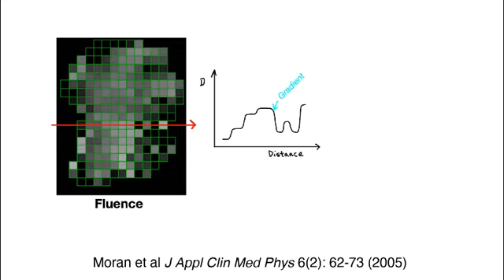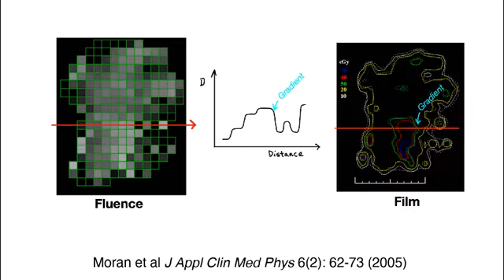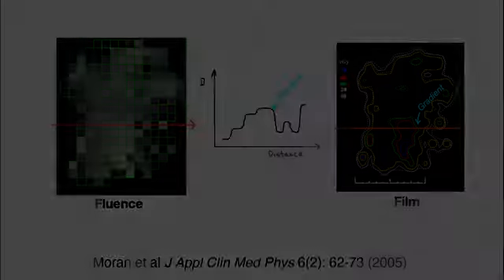Now we can also measure such fluence on the beam, and you'll see here a film taken of this exact beam as delivered. And we'll come back to this in our video about QA, but this shows that there's a way to verify the IMRT. So now I'm going to talk about how you would deliver such a complex fluence map. There are a couple different ways to do it. I'm going to walk through one of them first, and then we'll talk about the other ones.